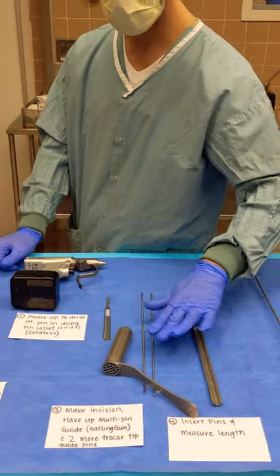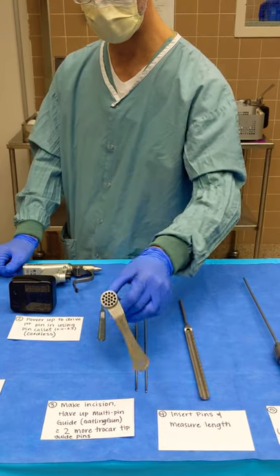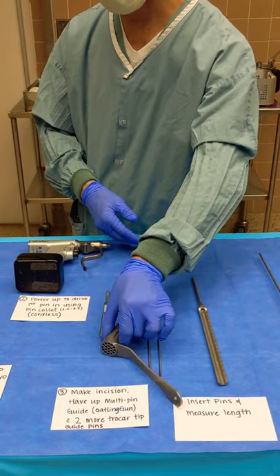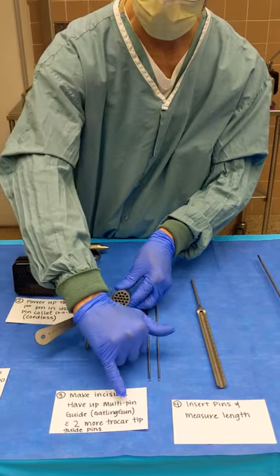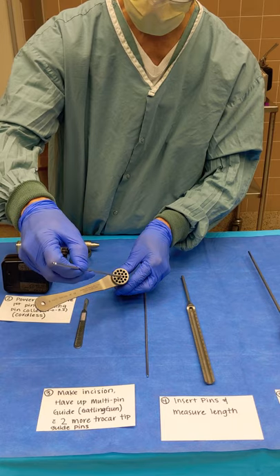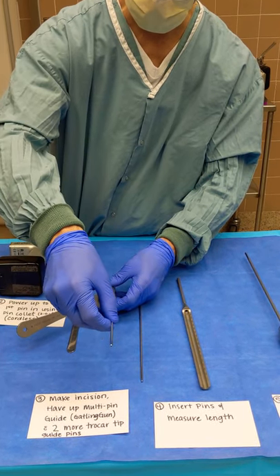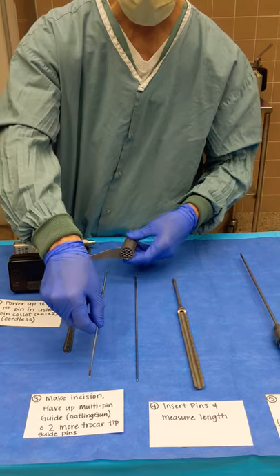Step three: we're going to need to put in a total of three pins. To do that, we're going to use this guide. To get that through the skin, we're going to make an incision — as you can see, it's fairly large. We'll put the guide, sometimes referred to as a parallel pin guide, with one pin in the center from the previous step, and then place pins next to that. You can put them in multiple places. They're going to use the cordless driver once again to drive those pins down into the bone.